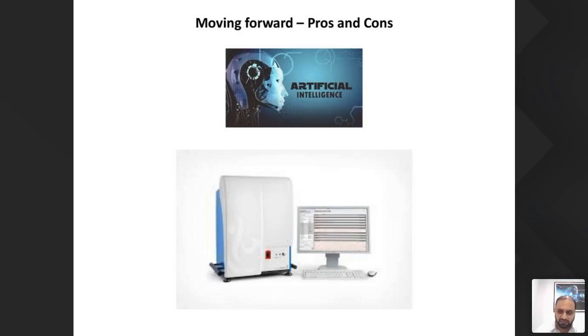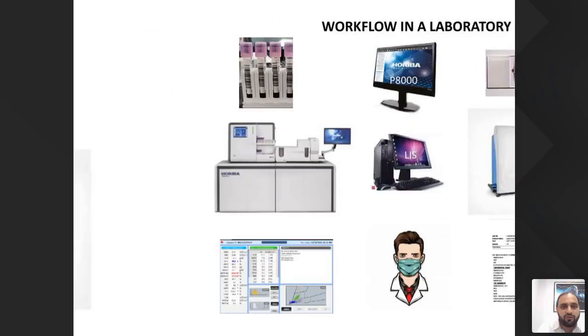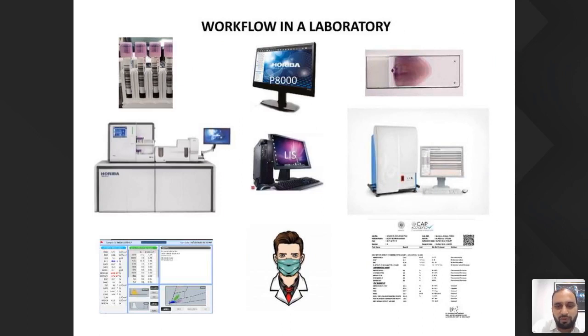So accepting this change might be difficult, but once you go through it, it is user-friendly. You will easily accommodate it and you will find the advantages. So what I feel is the workflow of my lab, which I would like to see in coming days. All this I've emphasized. I have replaced here my microscope with a CellaVision.